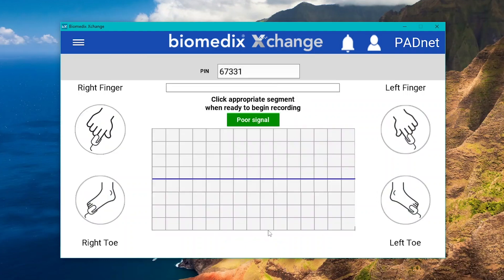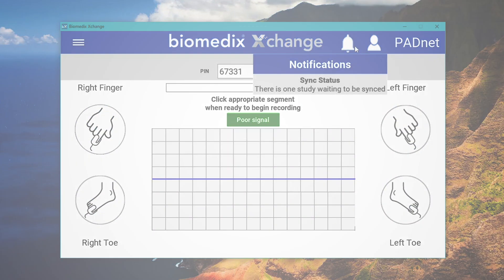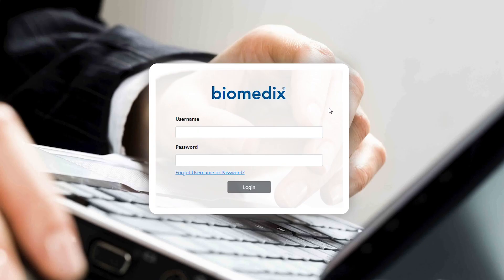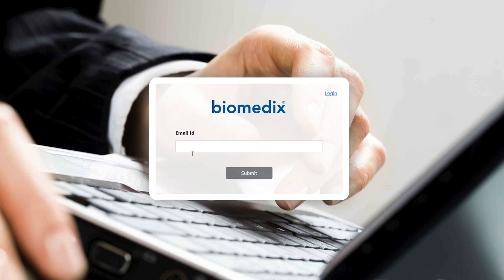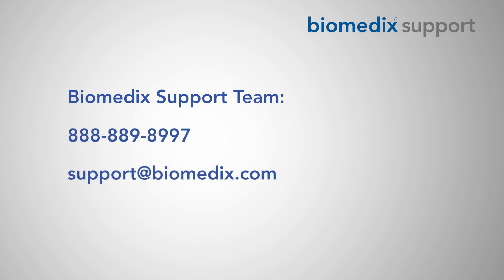Hitting save will save and upload the test results to the Biomedix Xchange web service, provided a stable internet connection is available. Uploaded tests can be accessed at any point on biomedix.us. If your account has been activated, simply head to the website in any web browser and log in with your work email and password. Passwords can be reset with the forgot username or password option. If you believe your account should have been activated but no credentials were ever received, contact our support team at 888-889-8997.